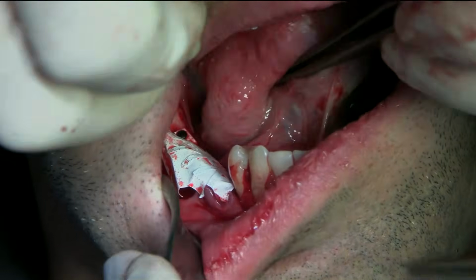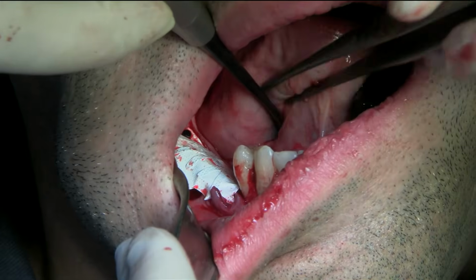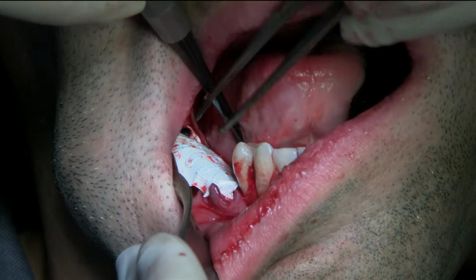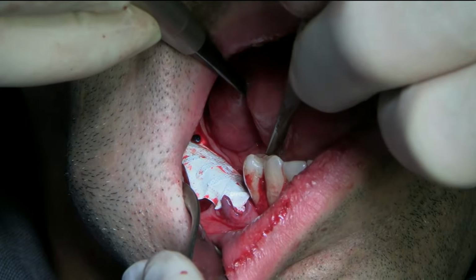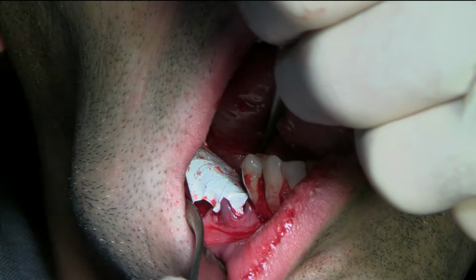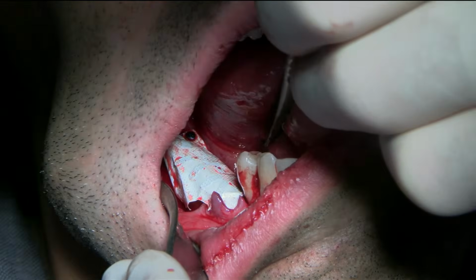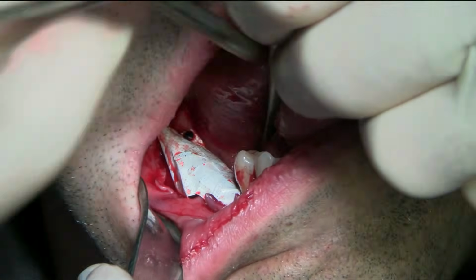Let's see. Mirror. Okay, the screw seems to be in the right position.